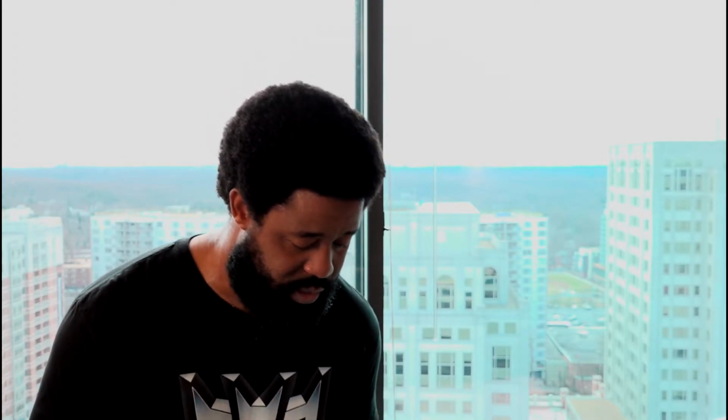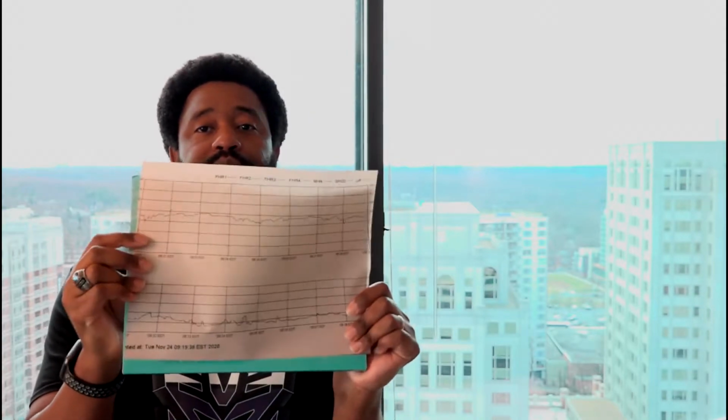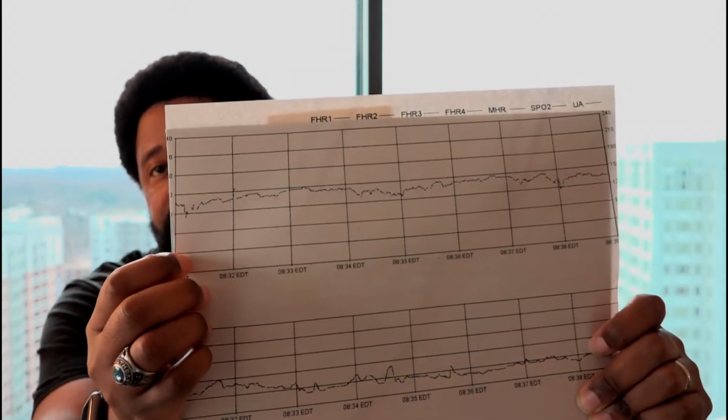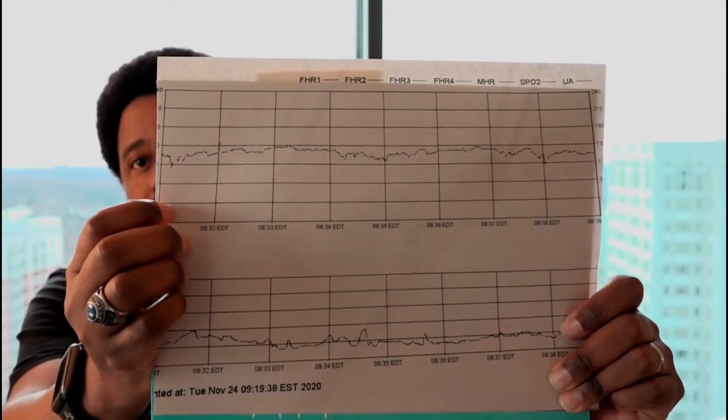Now, how does all of this work in the context of the strips, the electronic fetal heart monitor? I'm going to show you a quick example of what these strips look like. This right here is what we're discussing. This is what the strips would look like in some instances. This is just a simple example of an electronic fetal heart monitor and what the strips look like.